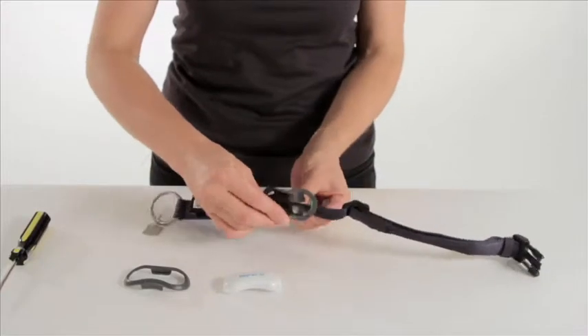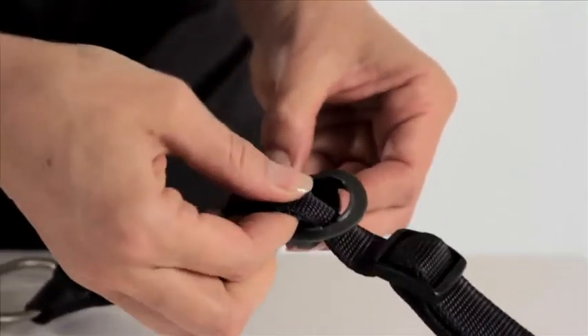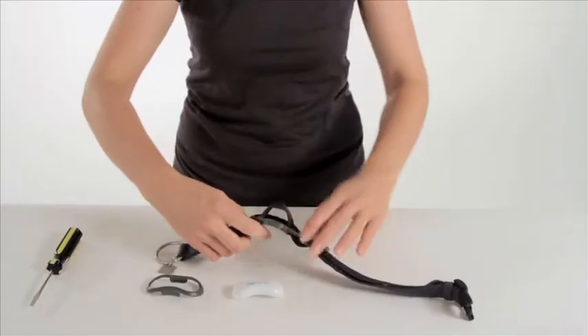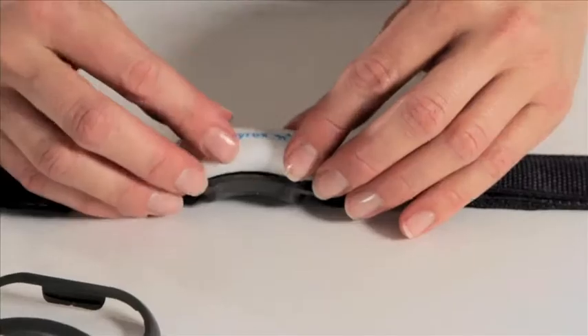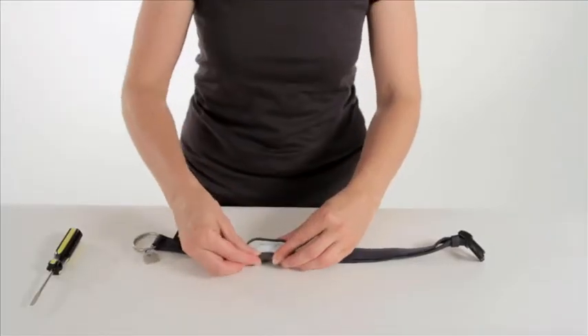Push the collar up through the back section of the surround. Place the biosensor on top of the collar. Clip the front piece into place over the top of the biosensor.